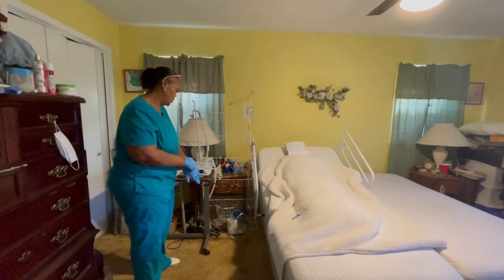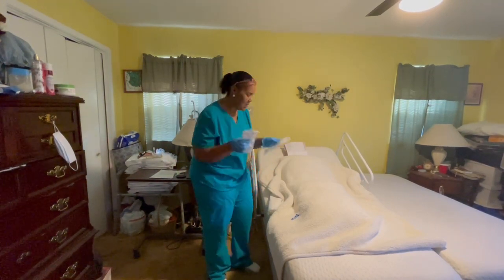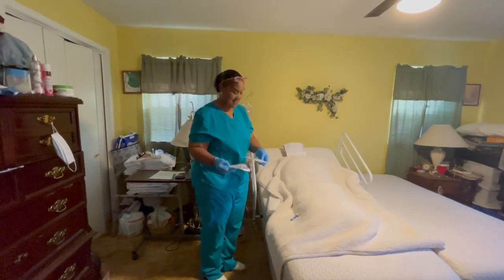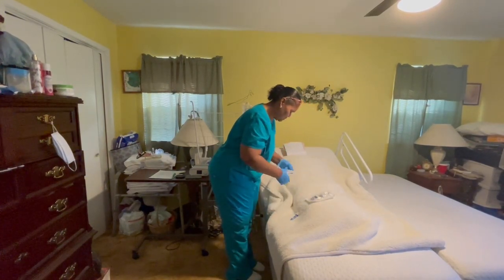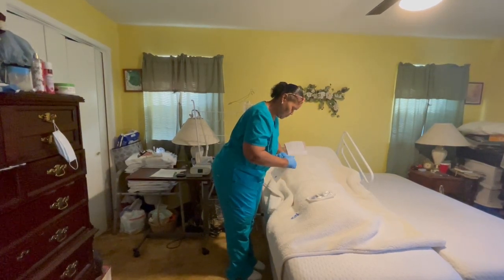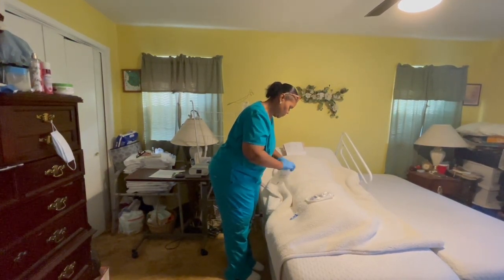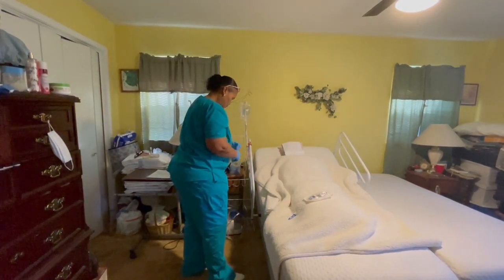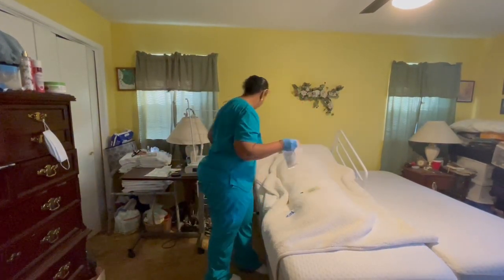Now I want to get my secondary tubing together. So I have my secondary tubing and I have my medications. Usually you will work on your stand, but unfortunately I don't have a stand at this time, so we're just going to pretend that there's a stand here. So I have my medication. I'm going to go ahead and open that. My medication, my secondary tubing.